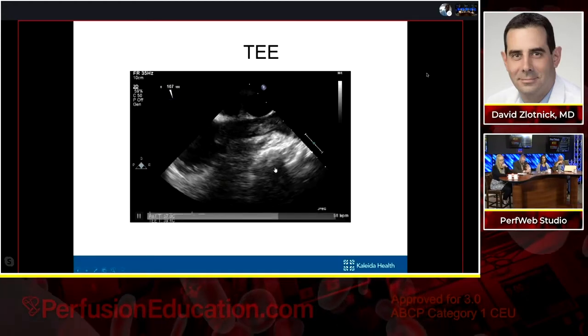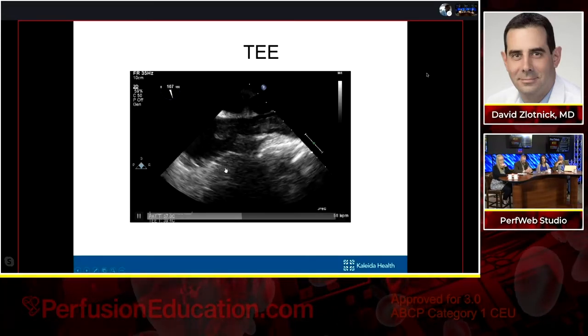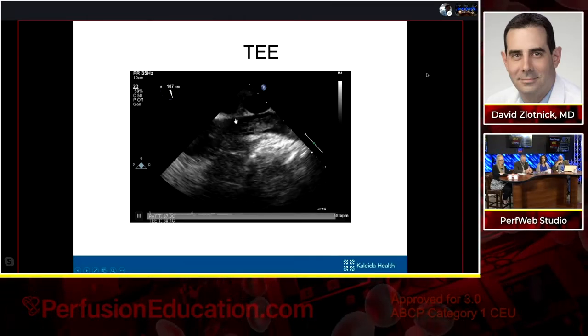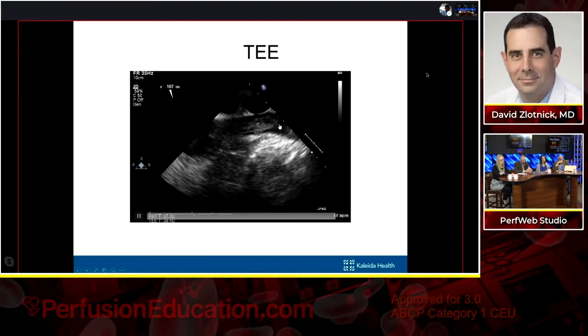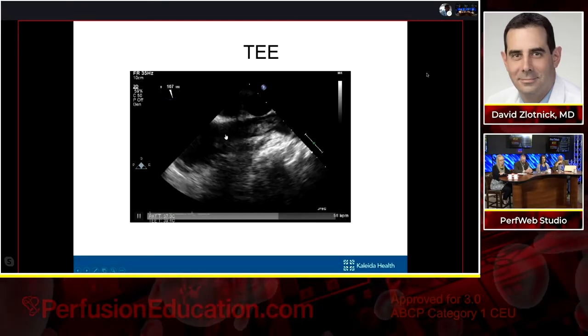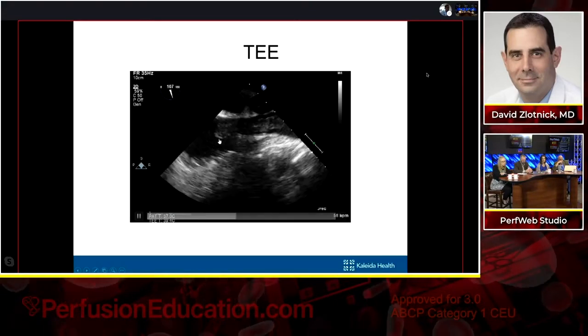And this is the transesophageal image. Just to orient people, this is the right atrium, interatrial septum, and this is the SVC. What we can see here is a large mobile thrombus in the SVC. You can see there's a mobile component right here at the SVC-RA junction.